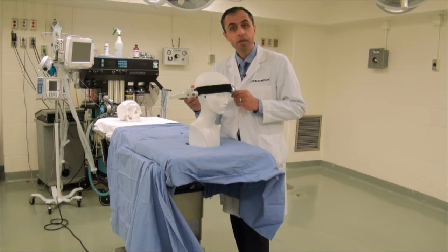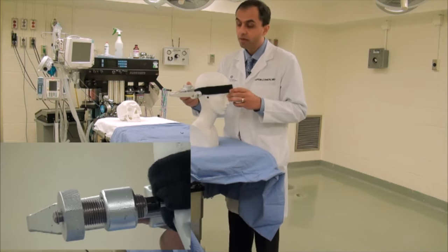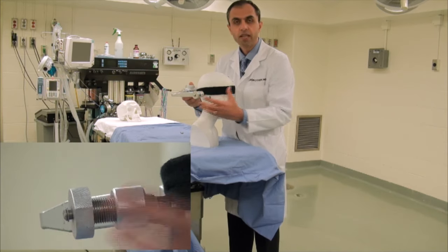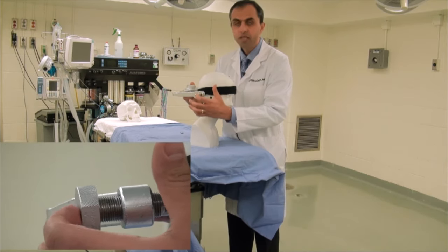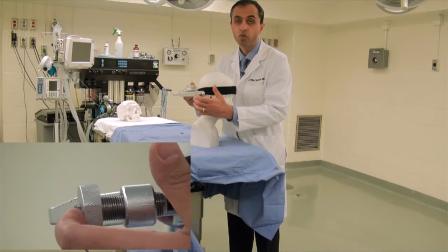Obviously, this depends on whether the patient is an adult or a pediatric patient. Let's review the details for an adult patient first. As the skull clamp is placed, we use the pressure or torque knob to measure the amount of force that the skull clamp would exert to fixate the head. Each line that sticks out of the pressure knob or torque knob corresponds to 20 pounds.